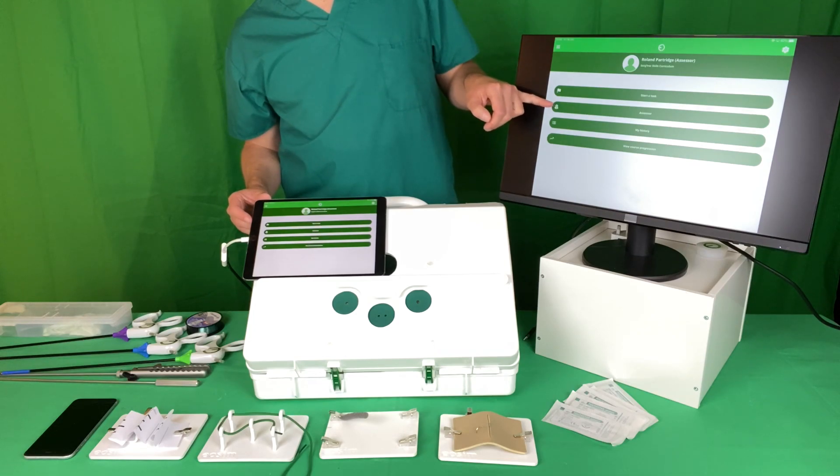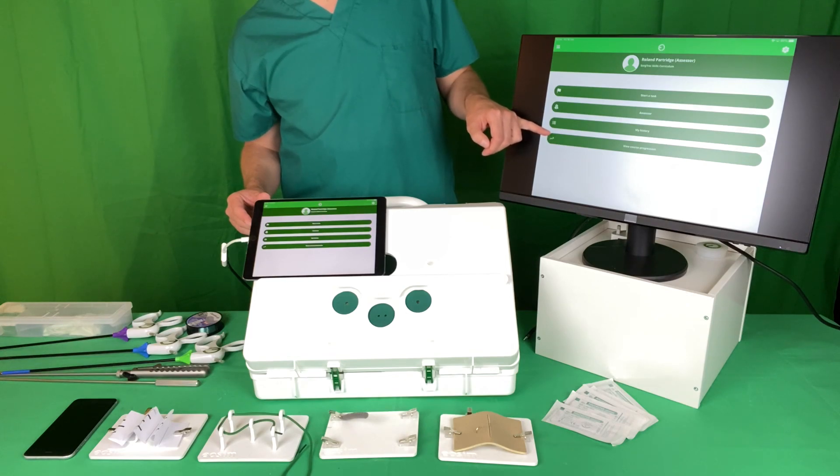Here you can see what the SurgeTrac application looks like. You have tasks, an assessor button which the assessors will have, the history, and a progress bar.